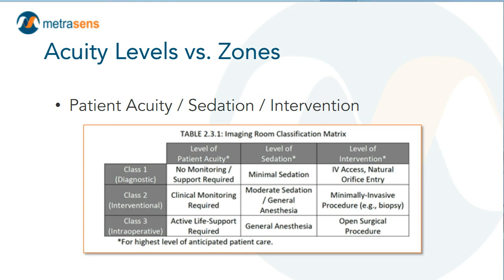And lastly, degree or level of intervention. We don't really consider starting an IV or natural orifice entry as an intervention per se, but maybe we're doing minimally invasive procedures, biopsies, or in a hybrid OR type of setting with an MRI, maybe we're actually doing full-blown open surgeries. So in each of these 3 categories, level of patient acuity, level of sedation, and level of intervention, we figure out what's the highest level in each one of those.